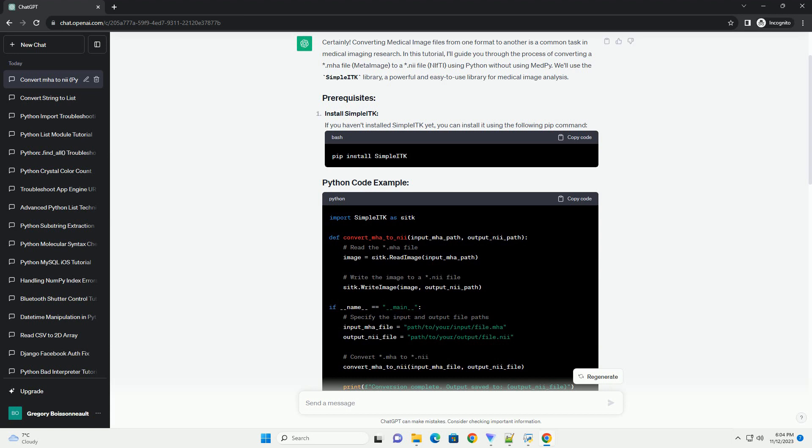Make sure to replace path/to/your/input/file.mha with the path to your actual input .mha file and path/to/your/output/file.nii with the desired output path and file name for the .nii file.